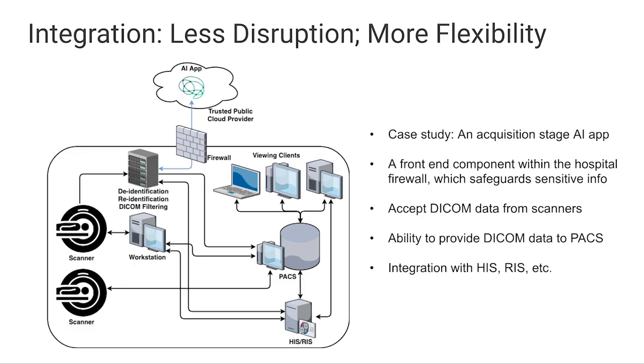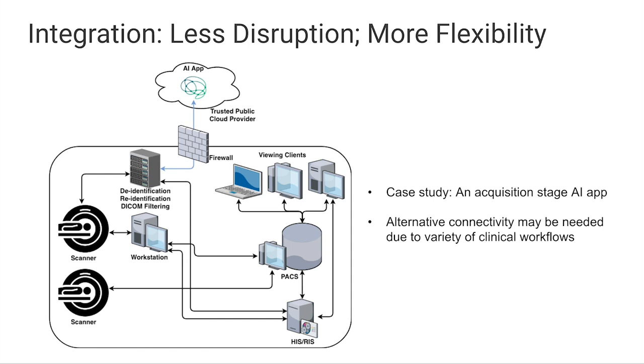So it's very common to implement these apps in this way, illustrated here. So the only change you're seeing in this slide from the previous slide is that the connection from the DICOM node is changed. It's no longer pushing image to PACS, it's pushing back to the scanner.